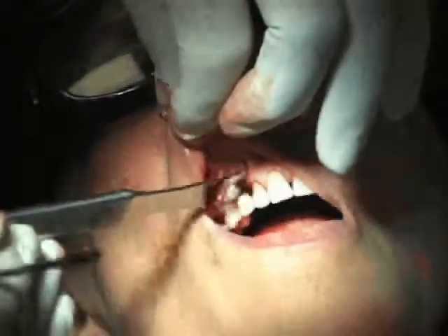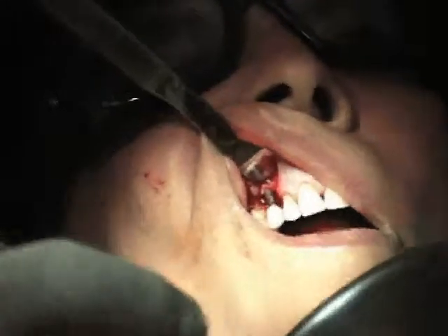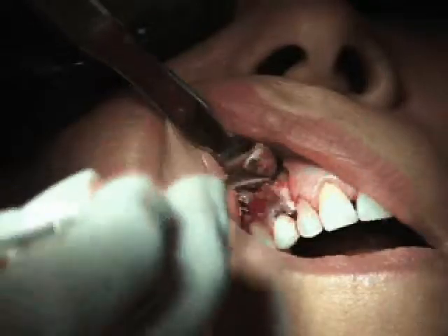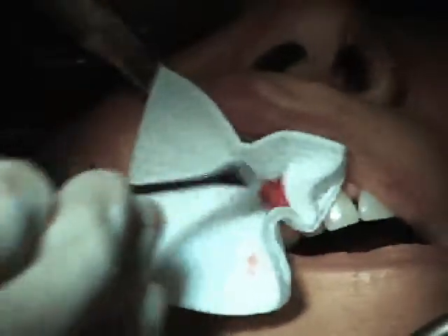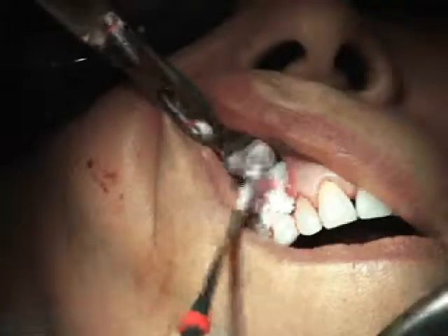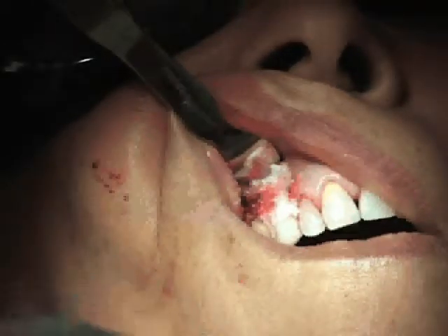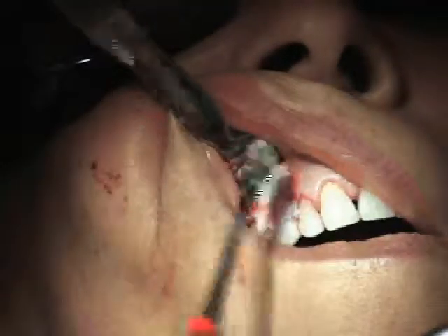Now we're going to do our graft. See how we have a little bit of blood? We're going to let the graft incorporate into the blood, because the bleeding bone has the precursors to what we really want to grow bone. It's like if you're growing cartilage, you want bleeding cartilage — you get growth from the bleeding structure or tissue that we want. That seems to be what you grow.